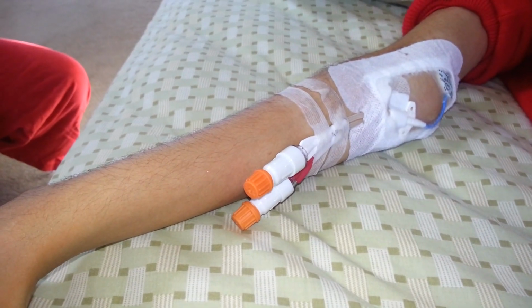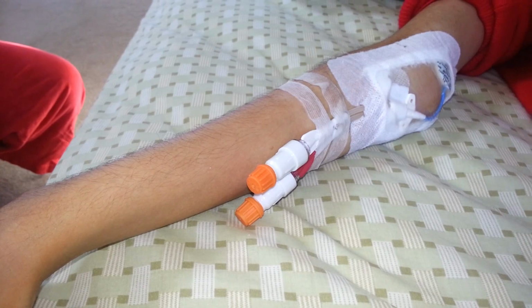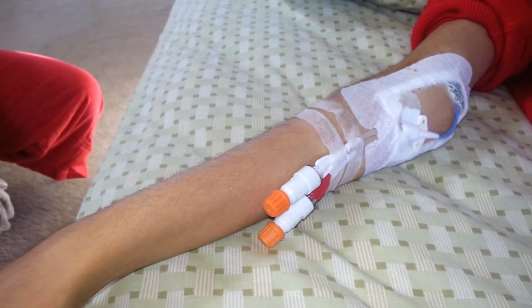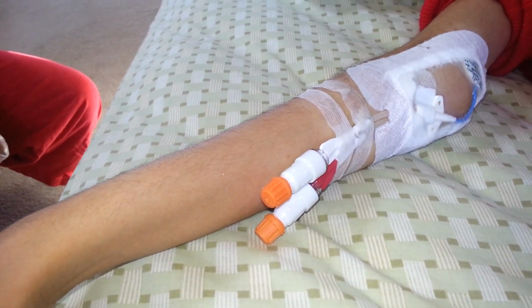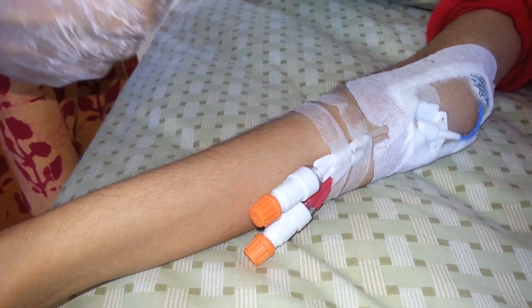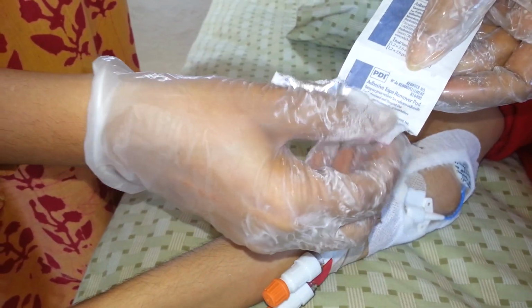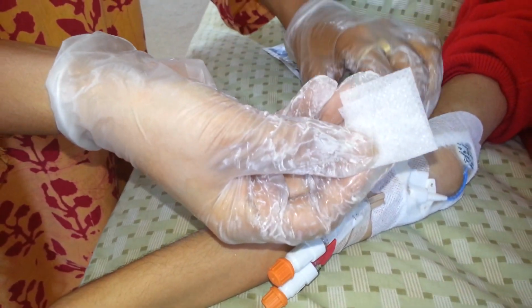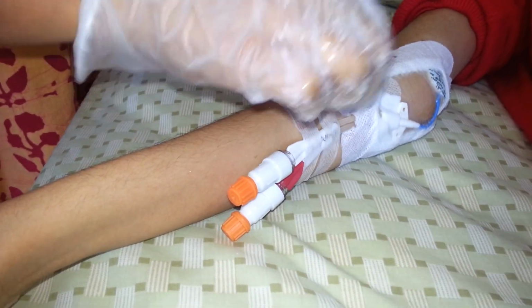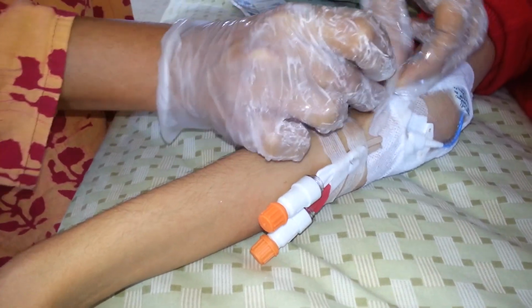My family member will now remove the old dressing. We make sure the catheter is secured with a tape or Steri-strip before starting the process. In my case, I have a Steri-strip. This is to ensure that we don't pull out the catheter when removing the old dressing. Wipe the top and sides of the old dressing with alcohol or adhesive remover pads. We use adhesive swabs instead of alcohol, as it very gently removes the dressing without any pushing, pulling or pain. We start from the edges and loosen up the dressing from all the sides.